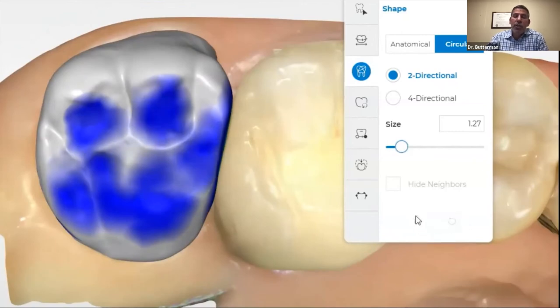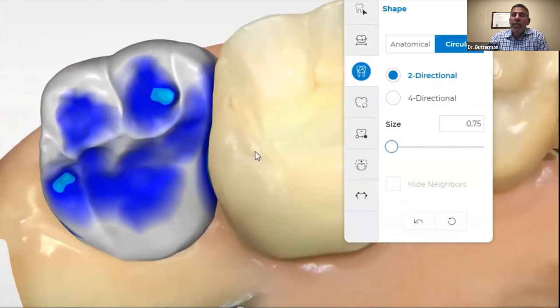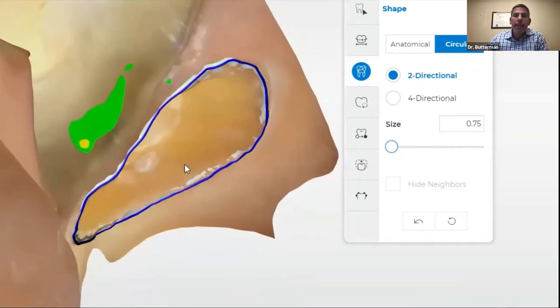Now, if you weren't paying attention and you just got a proposal and maybe you had some contacts on the distal half of the tooth like this, or maybe you got a contact on the mesial incline, and we don't have a stop on that mesial marginal ridge, something like this is almost going to guarantee that that tooth is going to distalize and this patient is going to come back with an open contact. So pay attention to this stuff. Don't just accept the proposals. On terminal teeth, make sure that you're dealing with that and getting that right, and make sure that your color is a little bit stronger.